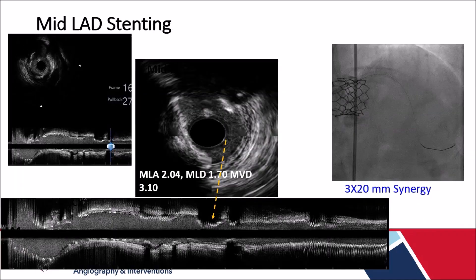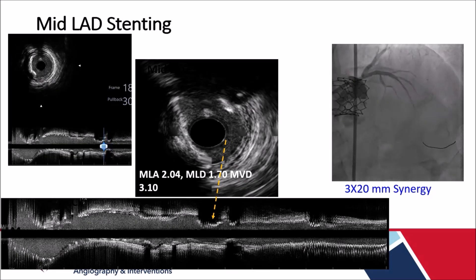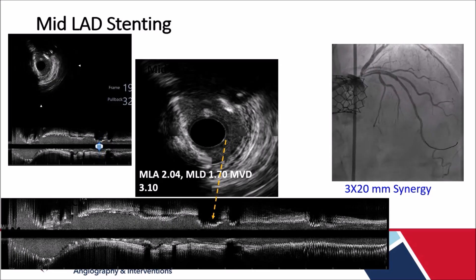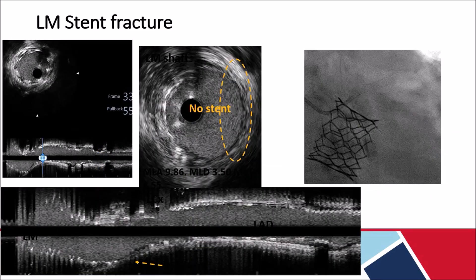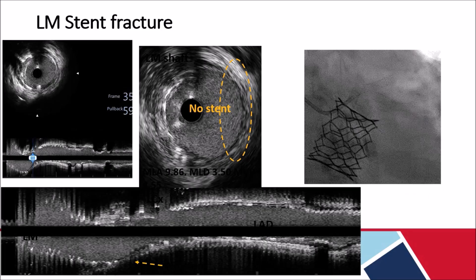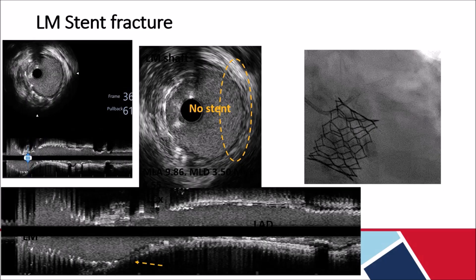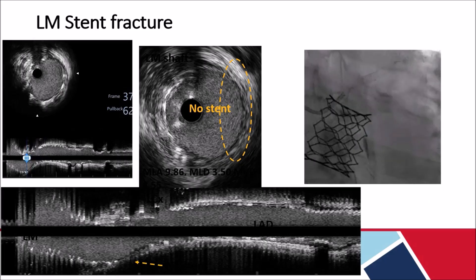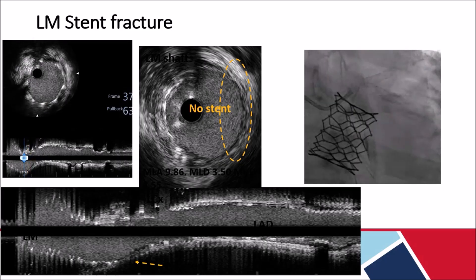IVUS across the LAD showed an MLA of 2.04 mm² across the mid-LAD, which was treated with a 3×20 mm Synergy stent. IVUS run across the left main clearly demonstrated the stent fracture, which was also evident in fluoroscopy.